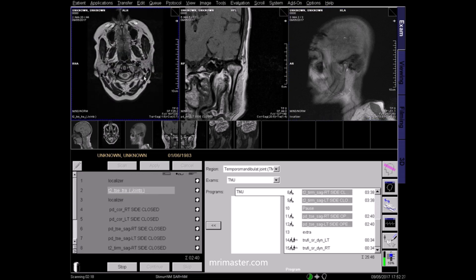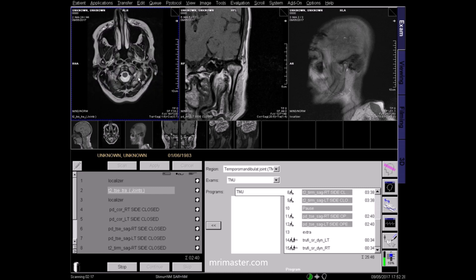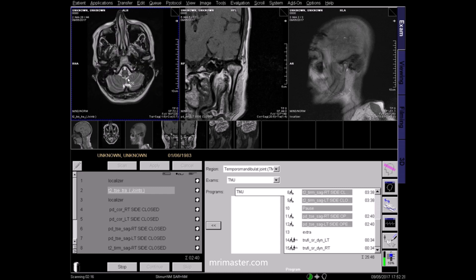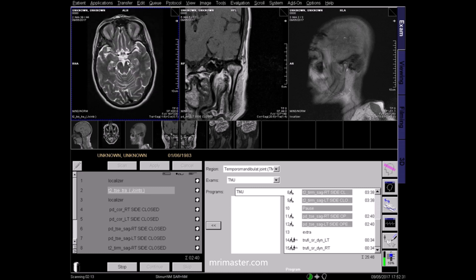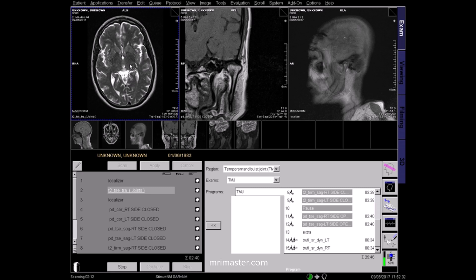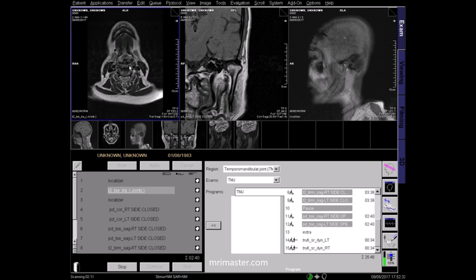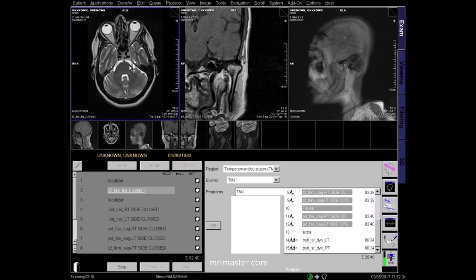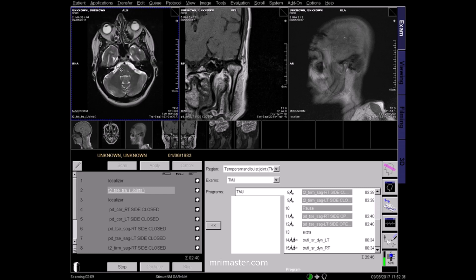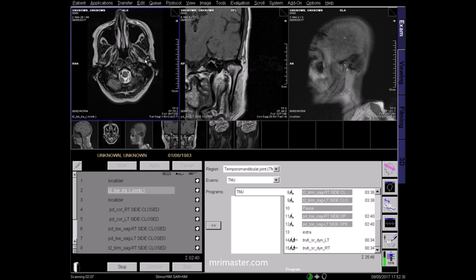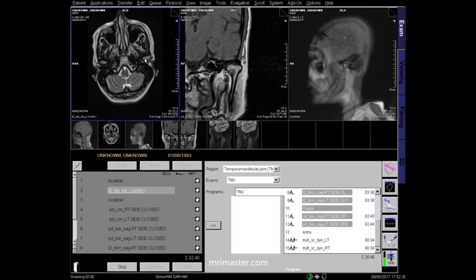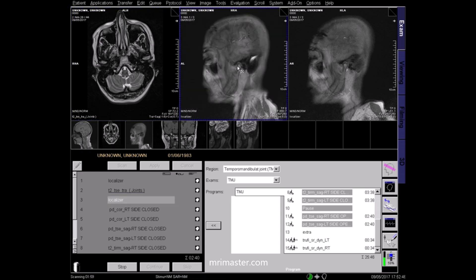You should have reviewed your images as the scan proceeds. When reviewing images, we're looking for good image quality. This is a T2 axial. In T2 imaging, fluids and fat appear bright. As you can see, the cerebrospinal fluid or CSF and the vitreous humour within the eye is bright in this image. Here's the left mandibular condyle and right mandibular condyle. This image is essential in planning all subsequent scans.